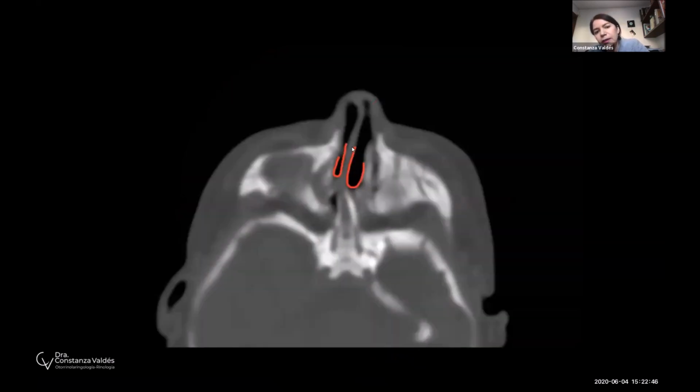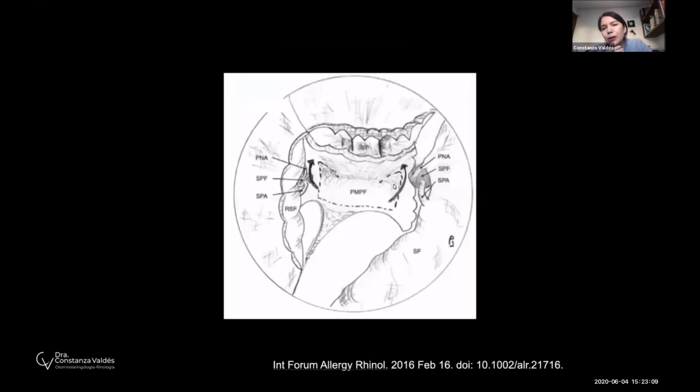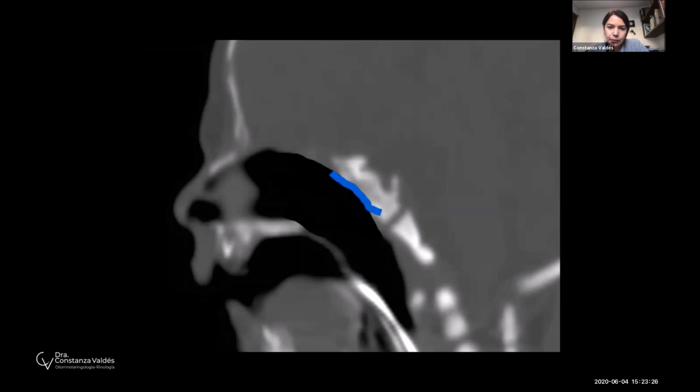And if you see a scheme in a CT scan, we're going to have 2 flaps depending on the posterior nasal artery that are going to cover all the lateral nasal wall. And it should be like this. These flaps usually are very big, so sometimes we have to cut them down and coagulate them so they fit perfectly inside the nose. And the 3rd flap is going to be the posterior part of the mucosa that goes posterior to the atresia, okay? And this one, we're going to flip over the sphenoid sinus. And if we see here a scheme, and we flip it over, okay?